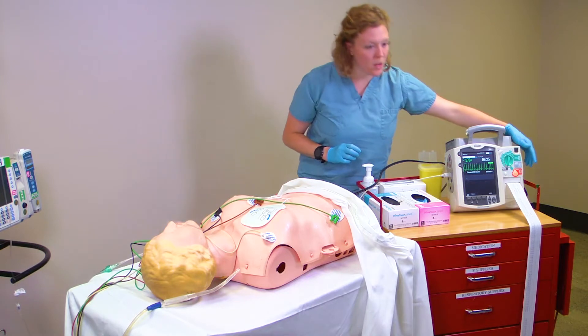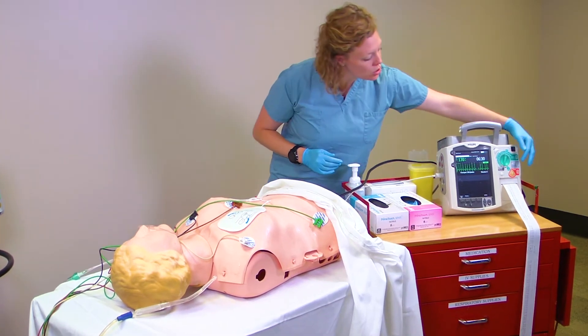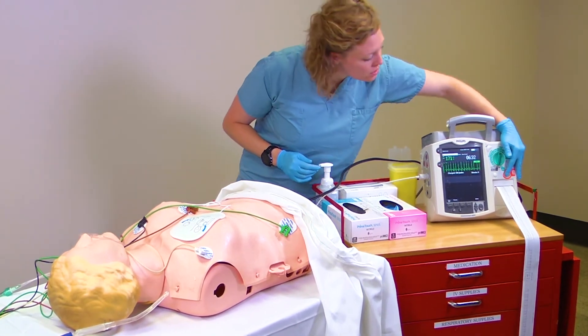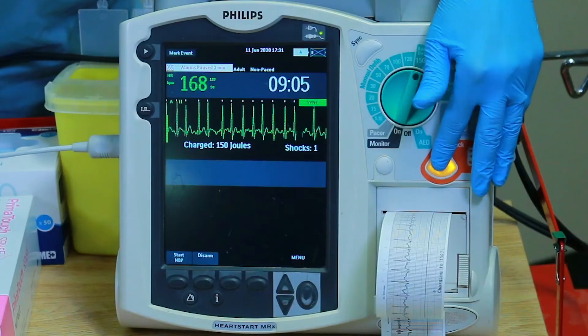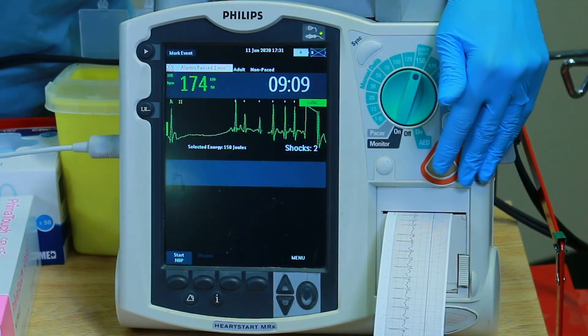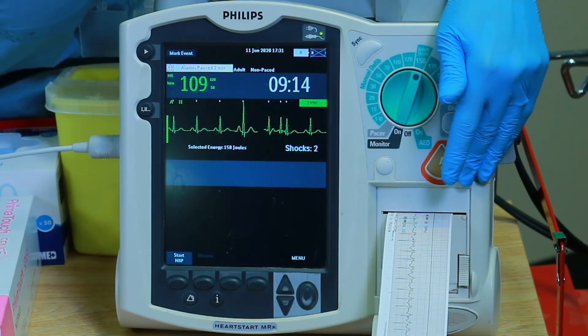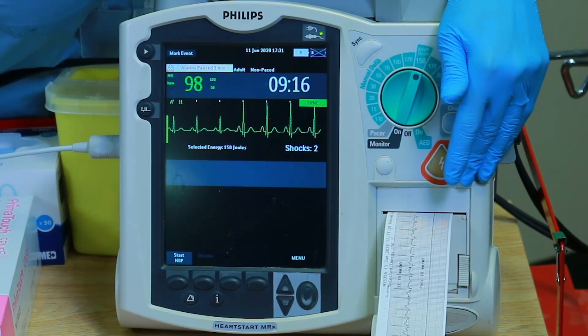The person pressing the shock button needs to state: I'm clear, you're clear, we are all clear, and ensure everyone is clear of the patient. Next, press and hold the shock button until the shock is delivered. The patient may show muscle contractions during the shock. A brief period of asystole of a couple seconds may be seen before the patient is converted to a normal sinus rhythm.